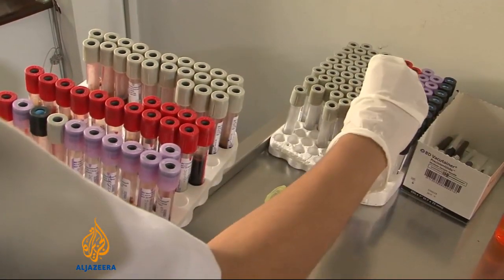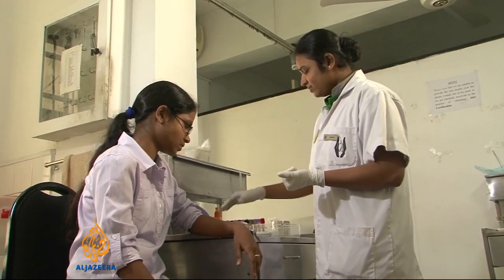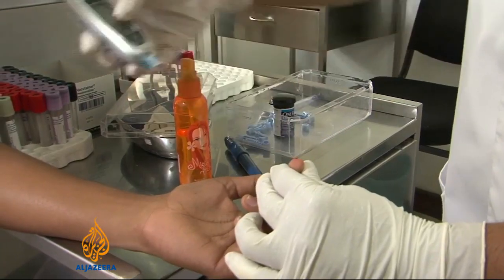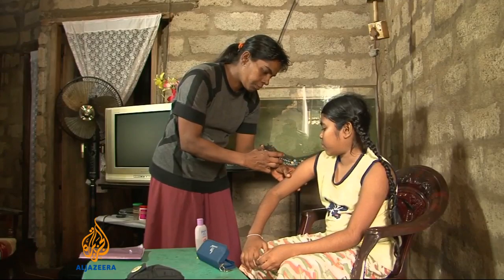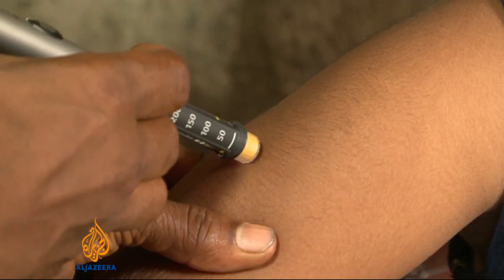Up to eight times a day, people with diabetes need to check their blood sugar levels. The needle prick is uncomfortable and the test kit cumbersome. That's why technology and medical companies are looking for a new way.